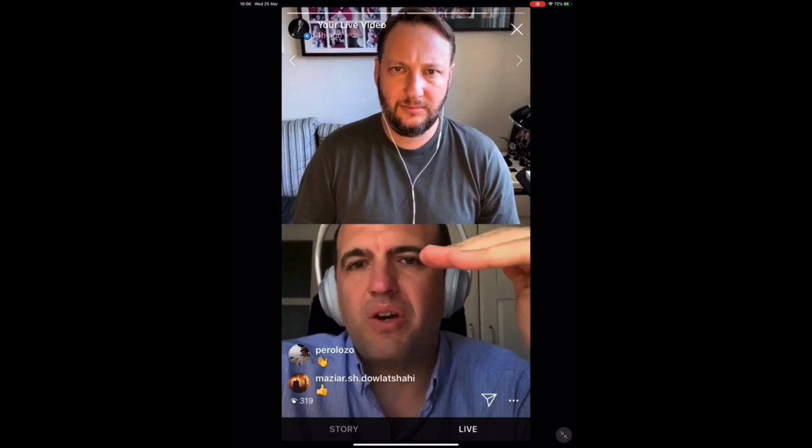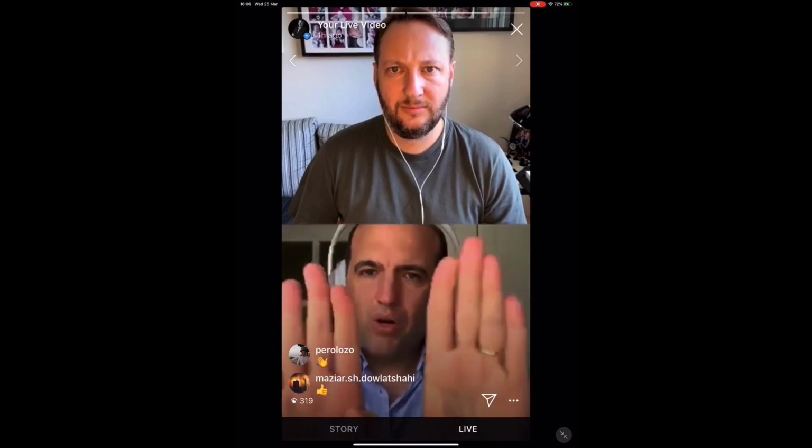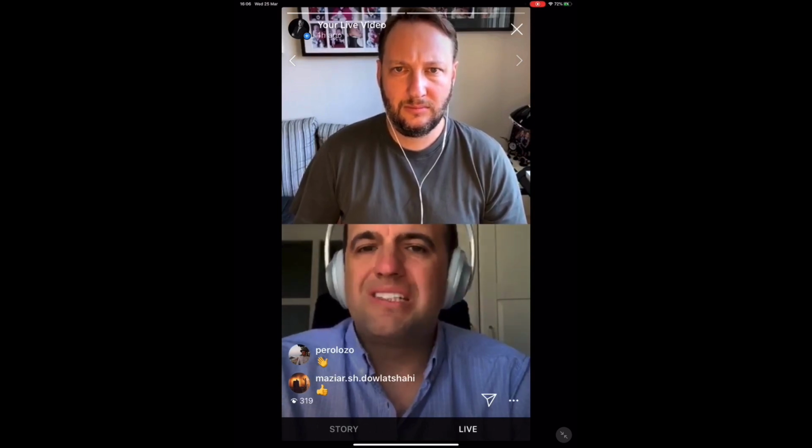First thing, your actual, current situation: this is you, okay? After this, I'm going to show the video of the actual situation next to the frontal smile and big smile photography. Then I'm going to show the 2D design, with the lines on the face, to explain what we have been talking about: that we have been doing a design, a facial analysis, a facially driven design of the patient.